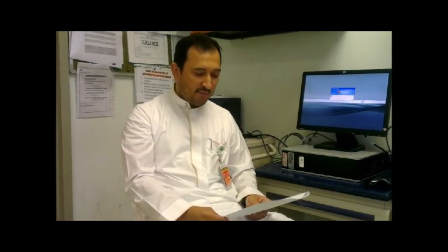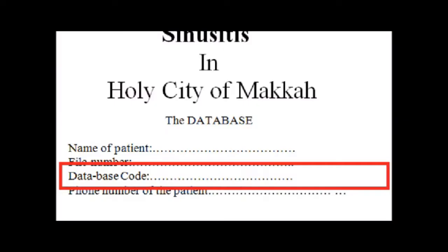One important thing is to label the secretions and the sample that you have accordingly to the patient database code that we have in the 1st page of the study and submit the questionnaire along with the sample to us.